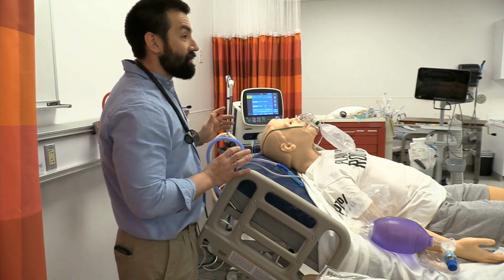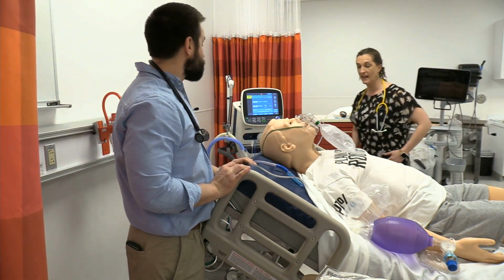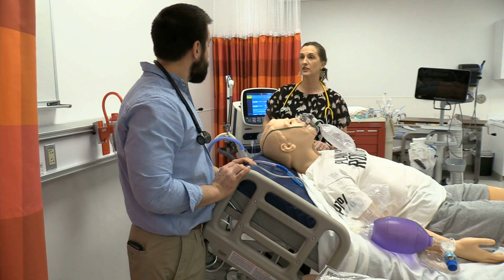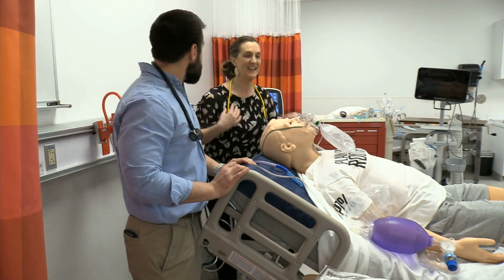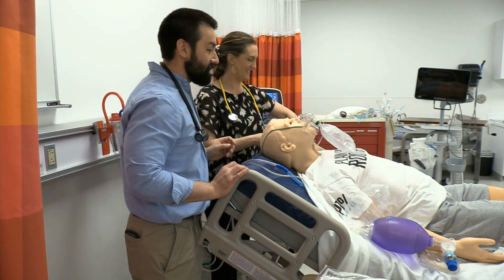So let me see if this doc's ready. Are you ready to put this tube in? I'm ready. I got paged at my conference. I heard you need an intubation. Yeah. All right. Thank you for bringing your nice stethoscope. I just wanted to make sure we'd have ability to hear some stuff afterwards here.